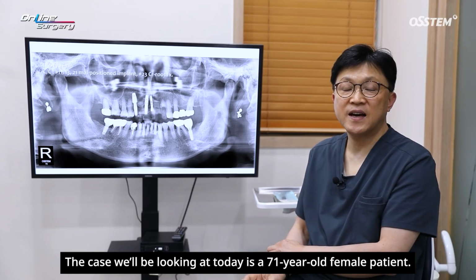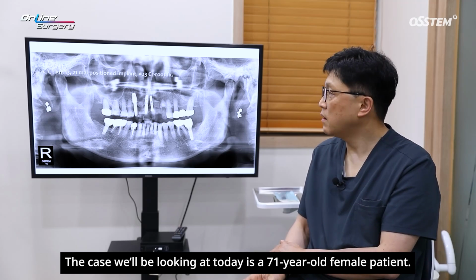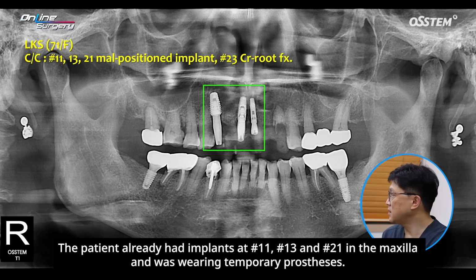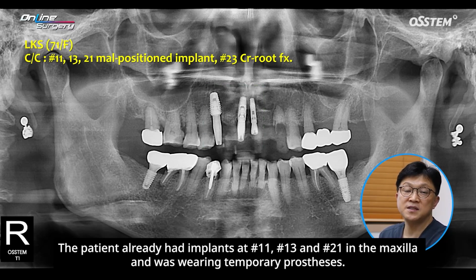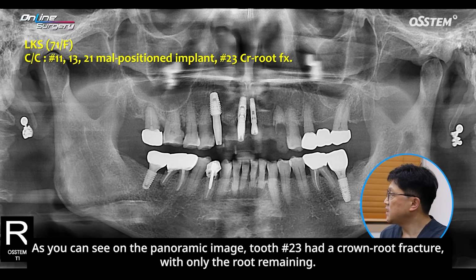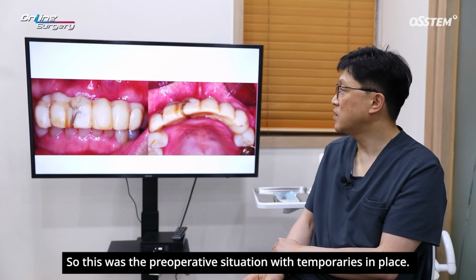The case we'll be looking at today is a 71-year-old female patient. The patient already had implants at number 11, 13, and 21 in the maxilla and was wearing temporary prostheses. As you can see on the panoramic image, tooth number 23 had a crown root fracture with only the root remaining. So this was the preoperative situation with temporaries in place.